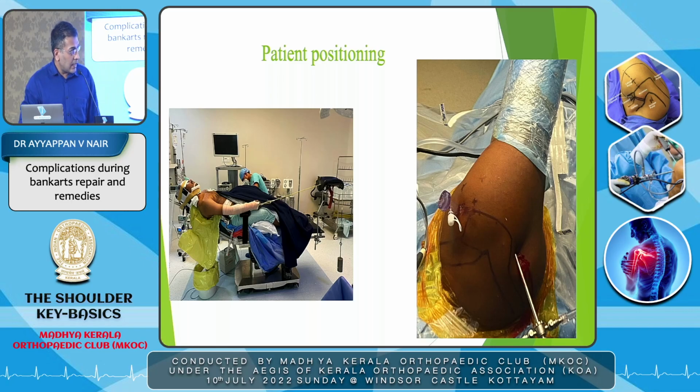the way I have figured out is, as John sir also mentioned in his talk, that he doesn't normally go all the way 2 centimeters here and here for the posterior port. Especially in lateral position, the head shifts a little to the lateral side, so it is always better to make an entry slightly at this level. It need not be 2 centimeters, because if you put it at 2 centimeters, you might go too much lateral, or too much medial this way. A line in line with this would be ideal for a good entry.